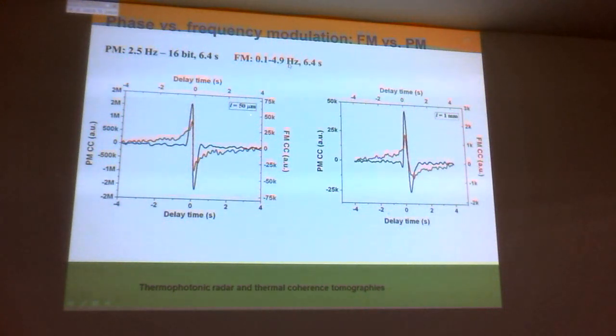You can see for a 50 micron thickness as opposed to 1 millimeter thickness, these are huge differences, but in both cases the code generated signal has a higher spatial localization than the sine wave, which is exactly what you want if you're to somehow beat the diffuse part so that you can increase your axial resolution, which is the problem.